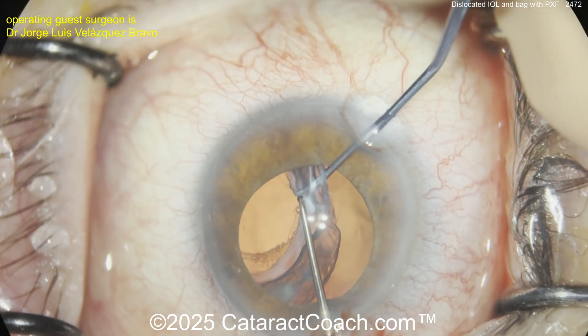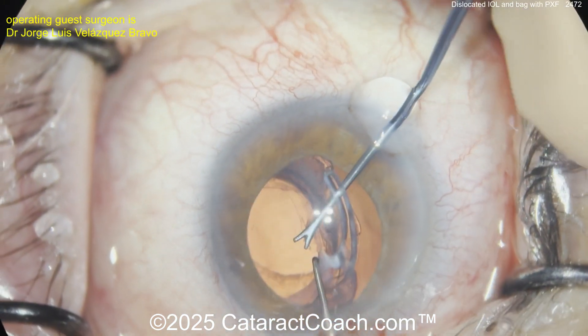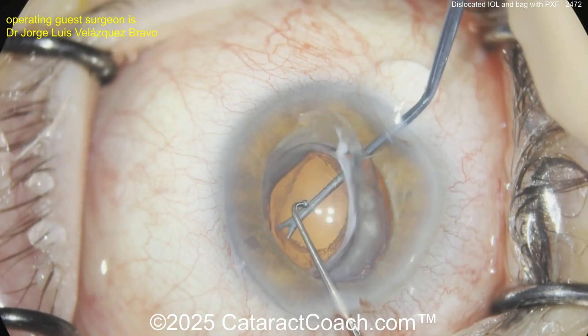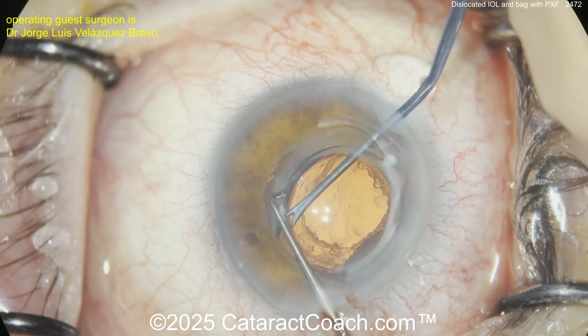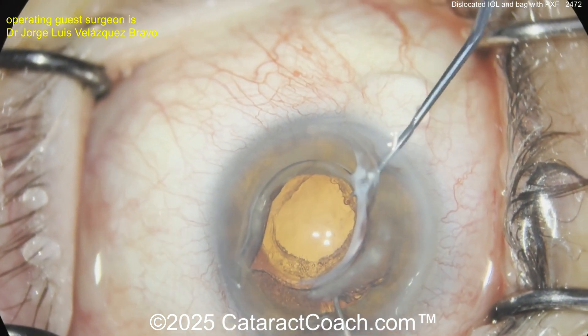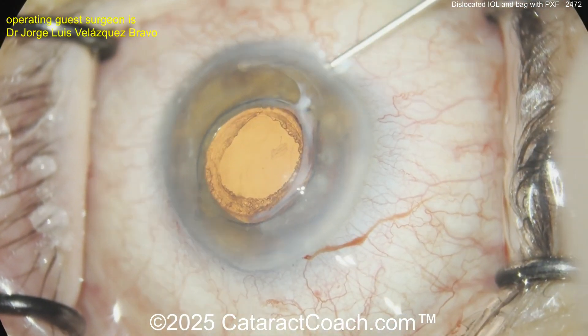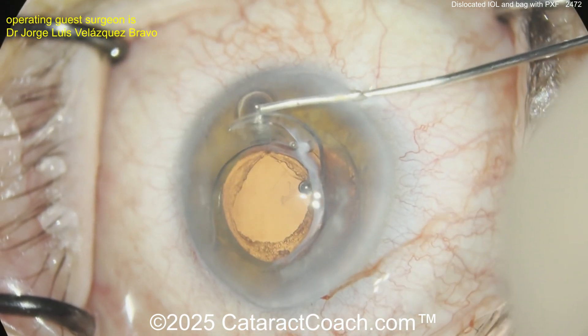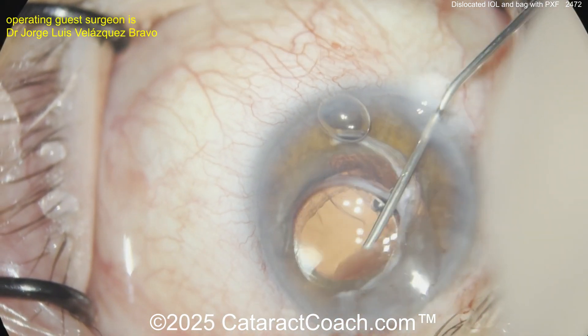It looks like a single-piece lens. The surgeon is grabbing onto it, trying to get it up. You're certainly going to have to explant this lens — look at that, the whole zonular ring, the entire capsular bag plus the IOL, the whole thing. It's a good thing you're bringing it up now; if you did nothing, eventually this whole thing would drop into the vitreous cavity. How would you explant this?